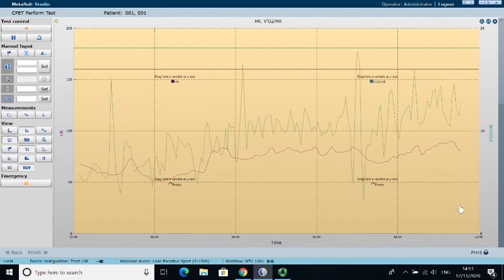And so on this one here, we're looking at heart rate. We can see heart rate starting to increase as exercise intensity does, so that's the one in the brown. And then we can also see this really shaky one in green, which is this oxygen pulse, which gives us a bit of an indication about stroke volume. So what it's saying is that early on in exercise, we're starting to increase our cardiac output due to an increase in heart rate and an increase in our stroke volume.